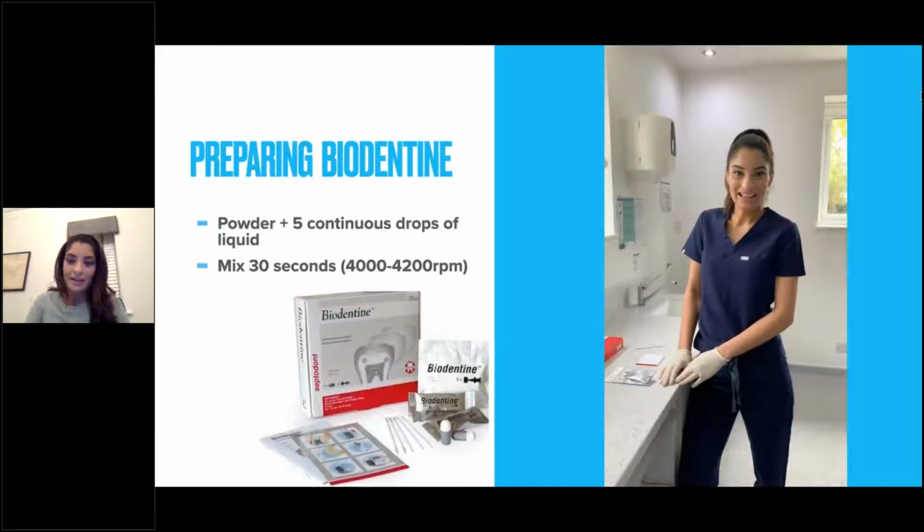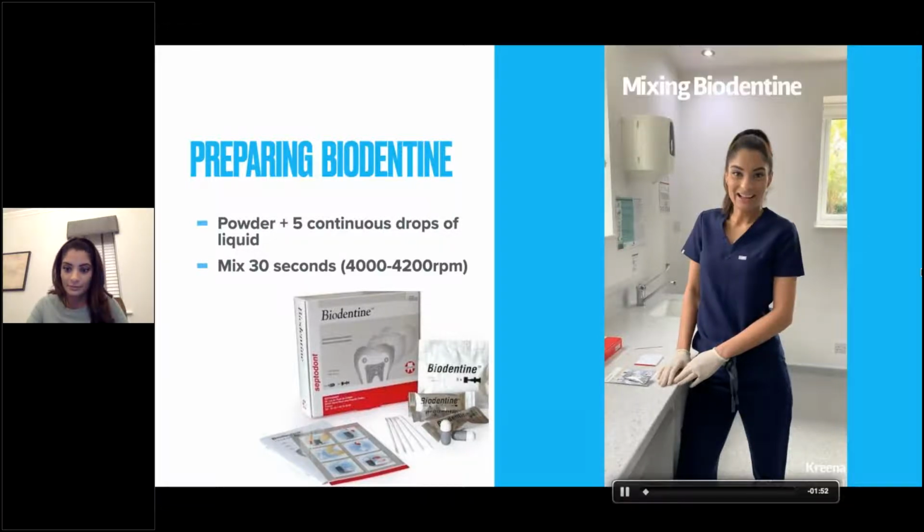Biodentine has to be prepared well in order for you to get the best mechanical properties out of it, and for you to have good consistency. So I've just made this short video on how you mix it. Hi guys, my name is Kreena Patel and I'm a specialist in endodontics. Today I'm going to be teaching you how to mix biodentine.